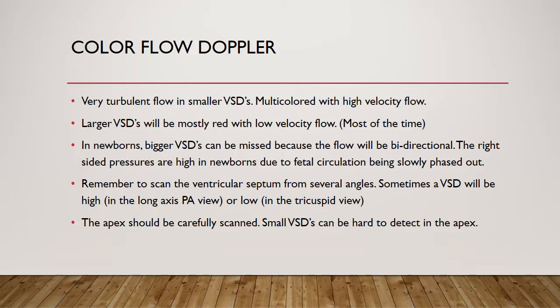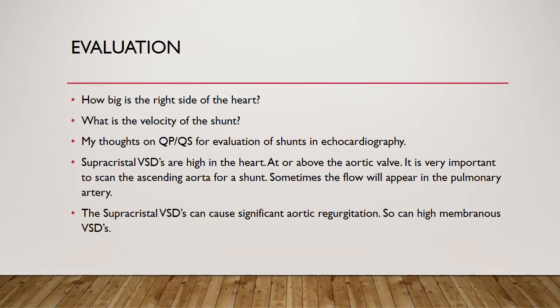Don't be surprised if you scan everywhere and can't find one — occasionally they are misdiagnosed. But if the doctor says they hear a VSD, it's probably you missing it. The apex should be carefully scanned; small VSDs can be hard to detect there. Sometimes you have to use a short-axis view and go way down to the apex to get them, moving the long axis over.